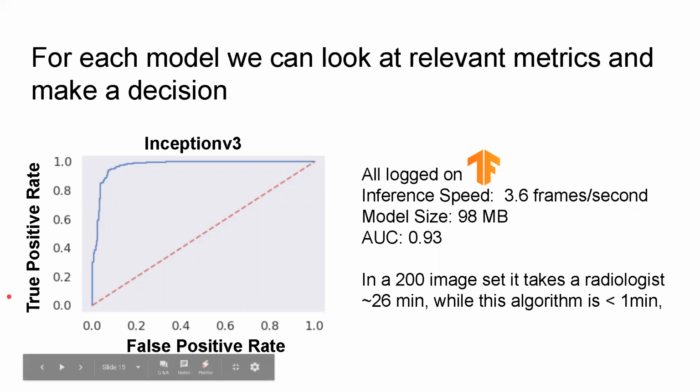And I just want to also say that we want to be right up here with a high true positive rate for medical imaging, because we want to make sure that a patient who is diagnosed as normal is normal and does not actually have a malignant tumor. We want high recall.